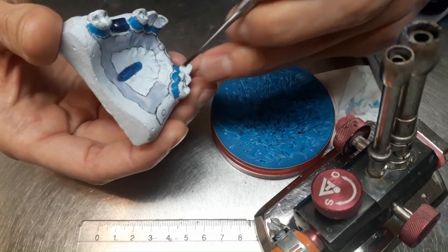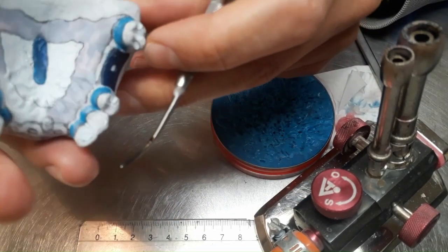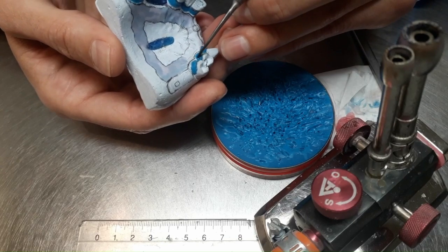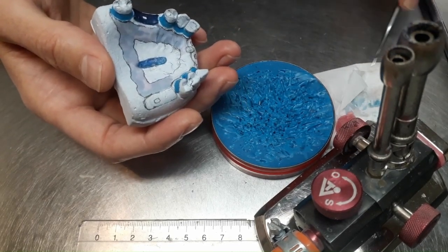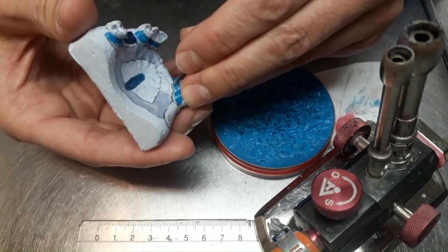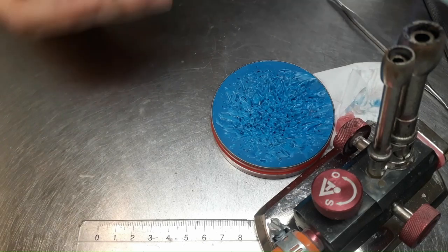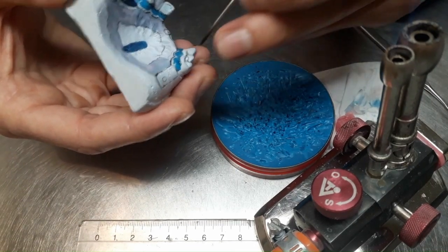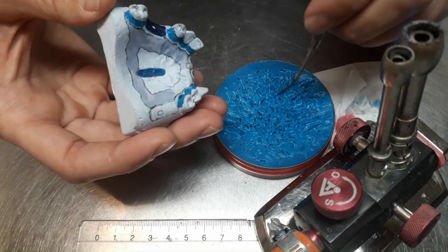On the same model, we shall place the teeth, the artificial teeth. Normally, for this we use the parallelometer, regularly. We have seen that before. But in this case, the technician dares to do it by hand, so to say, because there are no malpositions of the teeth, so it's quite easy to do it with the naked eye, says this technician, which is true for him. Yeah, that's true. He is a very good technician. But the best is to do it by parallelometer.